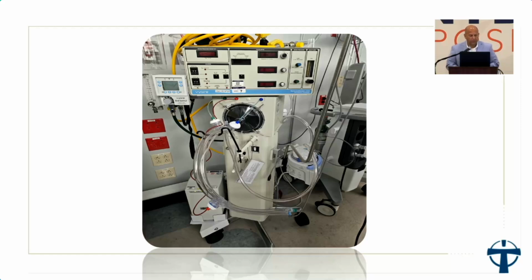The good thing with oscillators, with our practice and probably most places, is if you take them off the oscillator to maybe bag and suction, which in some places is a yes or no kind of thing, we would put it back on and increase the MAP or the PEEP about 1.5 of what it was before to re-recruit those alveoli. And it's almost the same thing when we go from conventional to oscillator. If your patient's mean airway pressure was probably 10, we're probably starting about 12, and just making sure we didn't flatten the diaphragm, we had good gas exchange, and again, we didn't cause too much decreased venous return.